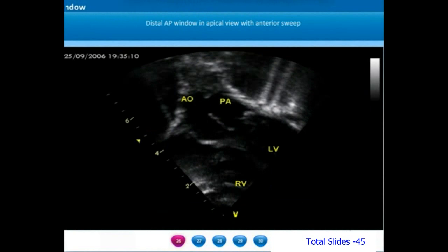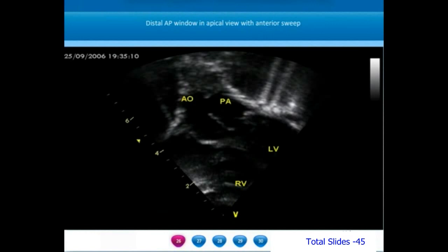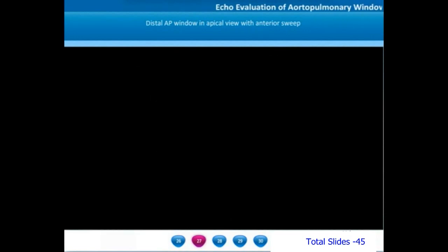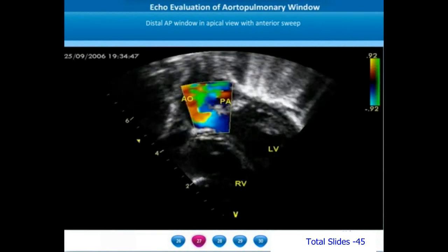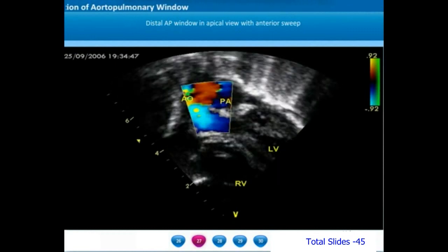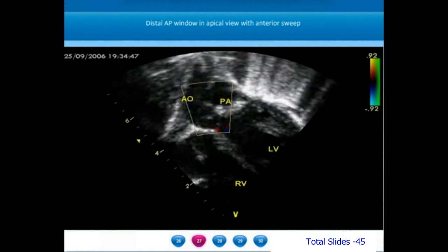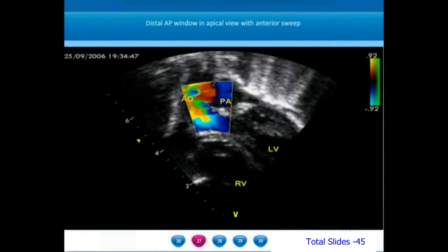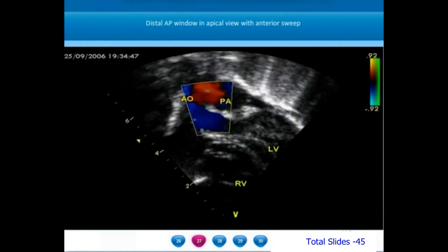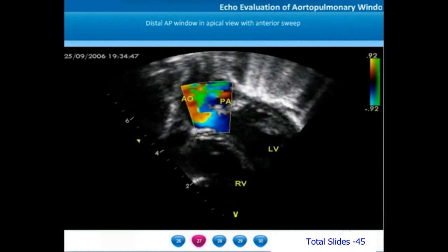When viewed from the apex with a significant anterior sweep, we are able to appreciate the ascending aorta, the main pulmonary artery, and the large distal aortopulmonary window. On color Doppler interrogation from the same apical view, we notice color flows across the distal large non-restrictive AP window. Note the laminar flows across the AP window — most AP windows are too large and will not produce turbulent color flow.